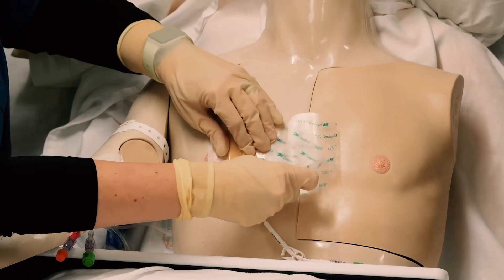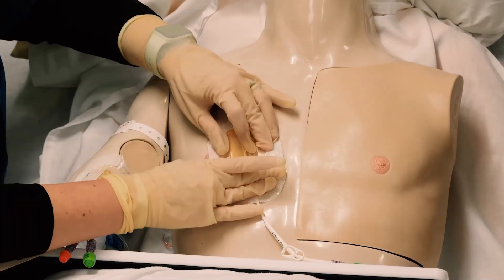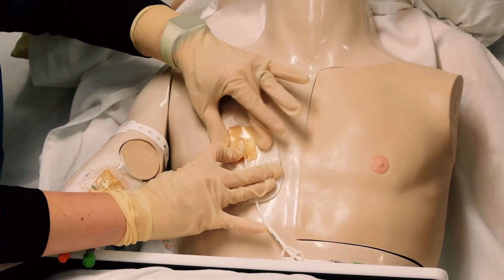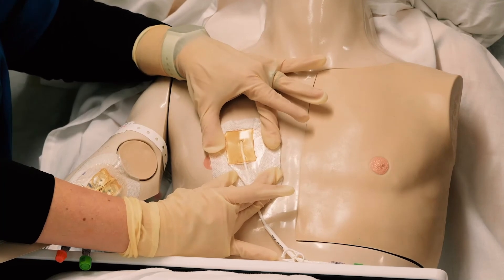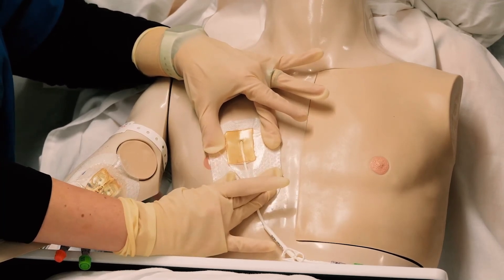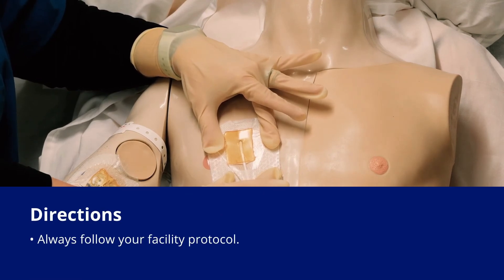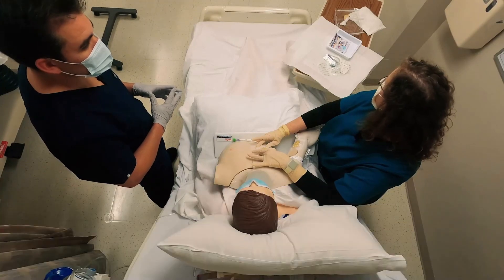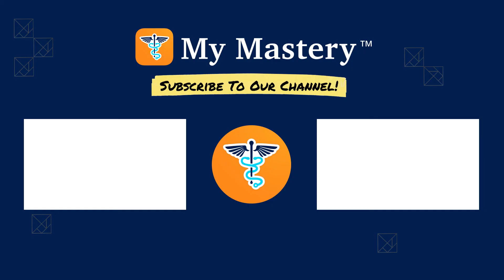You don't have to do this in exactly this order — you could pull this off first. It's important that the site is in the middle of your CHG. Then you're going to sign and date your artwork so everybody knows when the next dressing change is due. That wraps it up for the subclavian central line dressing change.